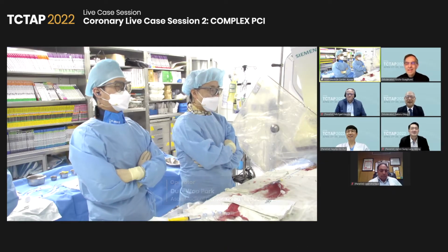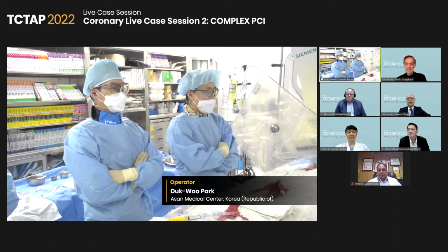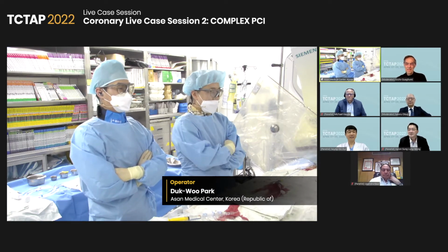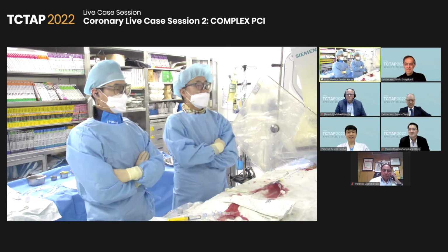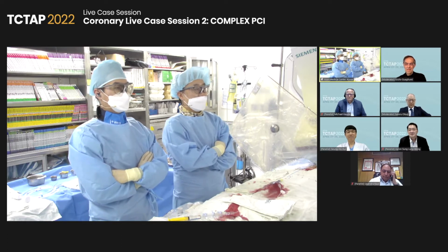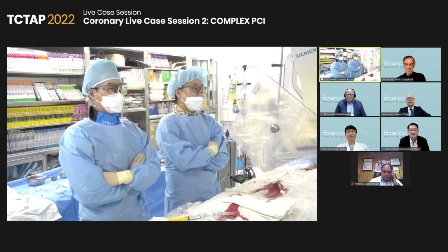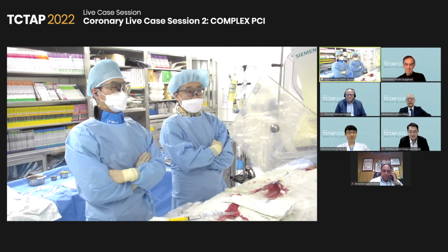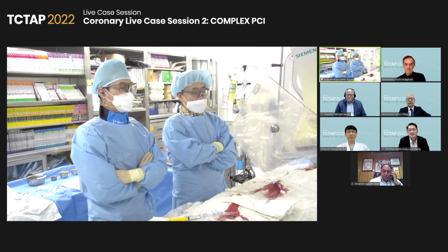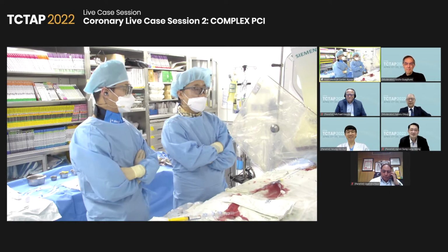Welcome to the TCTAP 2022 live case demonstration. In this session we prepared two very interesting cases. The first case is less complex, and the second case is much more complex.